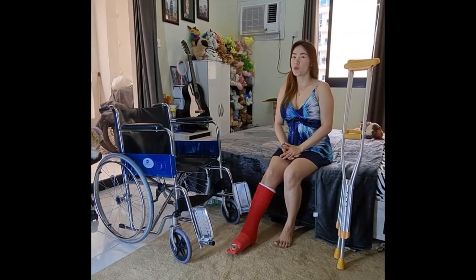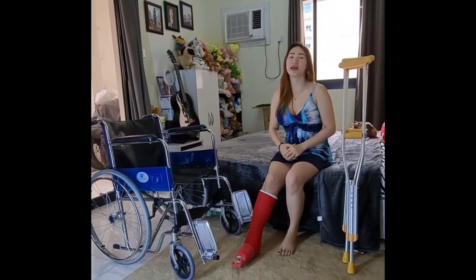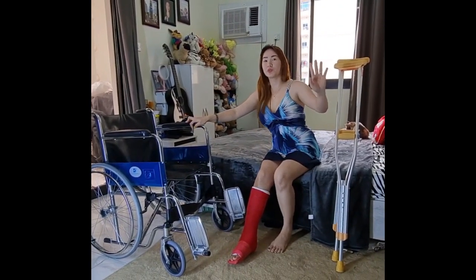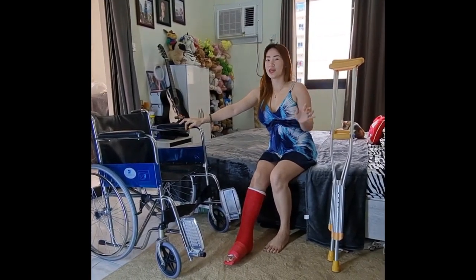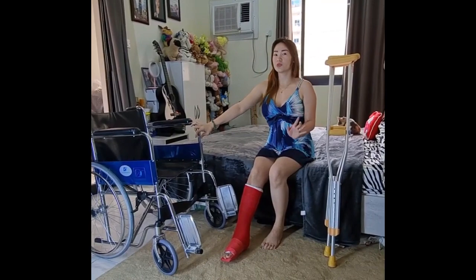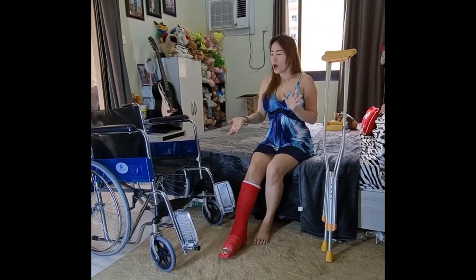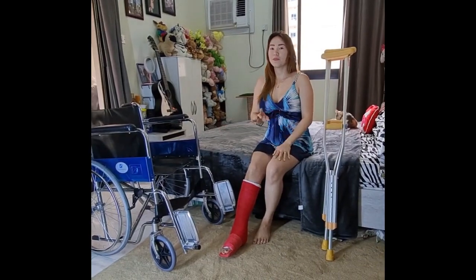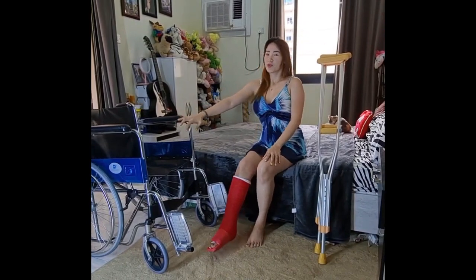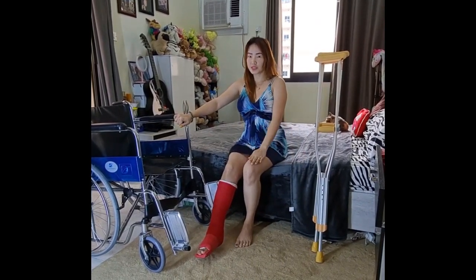Hi guys, for today's video I'm going to show you my daily routine every time I go to work. When I go to the bathroom or kitchen, I use either of these two pieces of equipment — as you can see, I'm using a wheelchair and crutches. These are safety tips based on my own experience only.